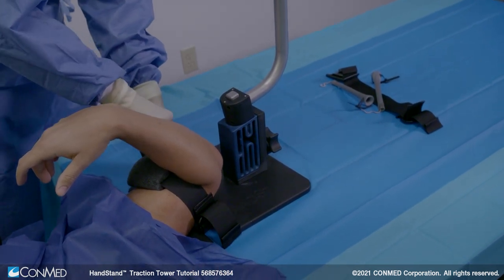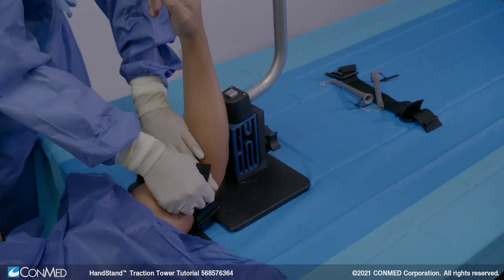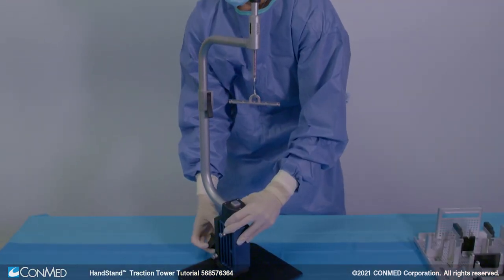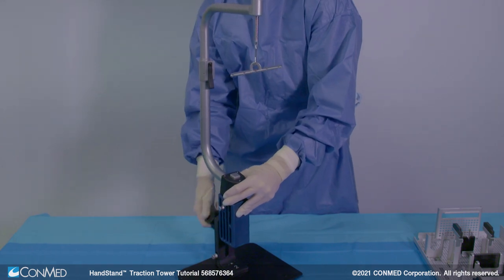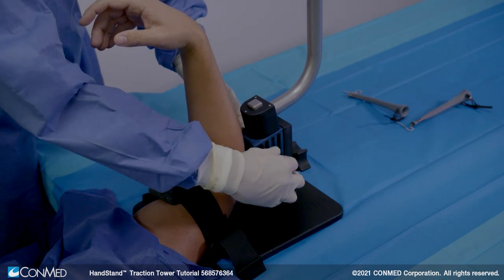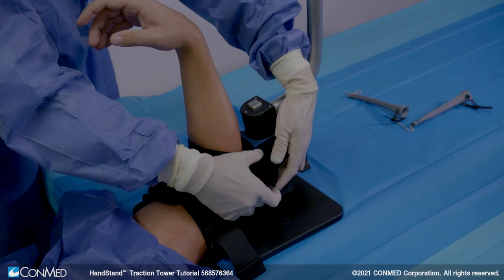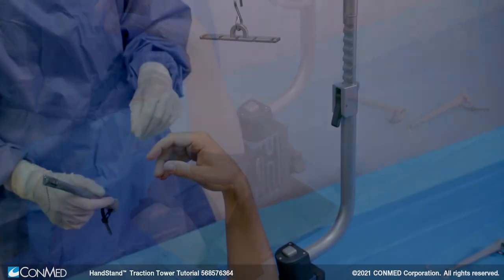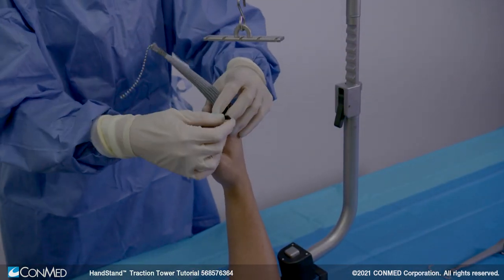Then, ensure that the foam on the bicep strap is centered over the patient's arm. Next, place the patient's forearm against the recess in the upper tower. The height of the upper tower can be adjusted depending on the patient's forearm length. Insert the forearm strap buckle bracket into the upper tower and wrap the forearm strap around the patient's forearm. Lock the buckle into the bracket. Adjust the strap length until the patient's forearm is secured to the upper tower. Place the digit traps on the appropriate fingers to obtain the desired traction.